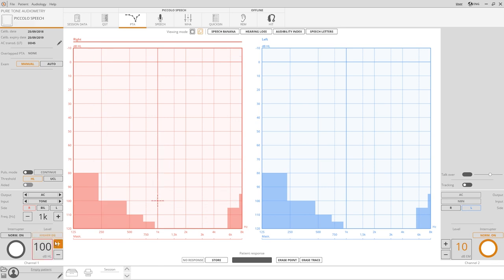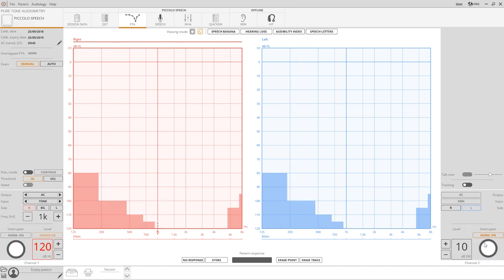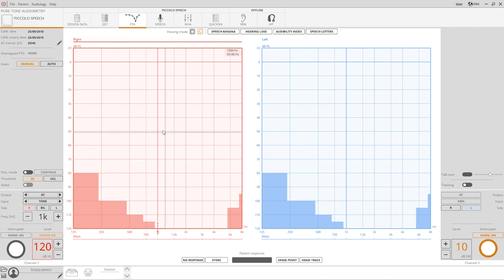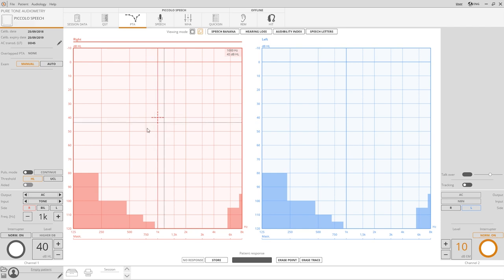Click on higher decibels to confirm the intention of testing intensities above this level. Interrupters are available for both channels 1 and 2. Simply move the cursor over to the circle on the screen or right-click on the area with the audiograms to send the stimulus.